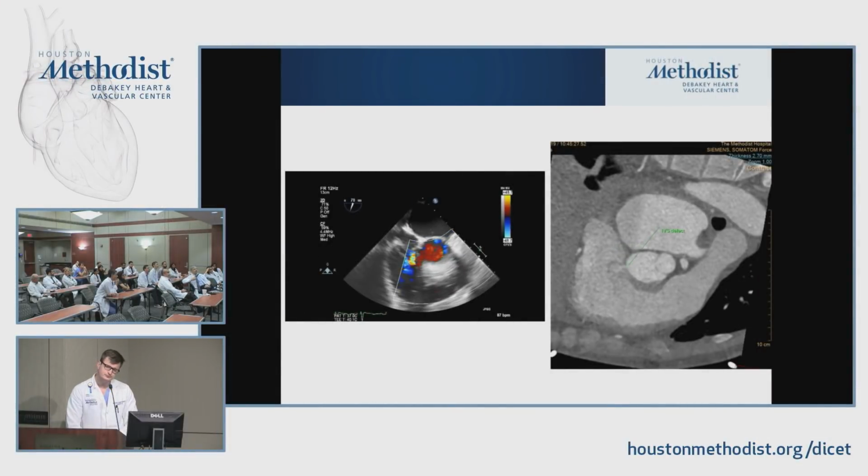What gets me concerned when you do CTA, right, is that it's hard to see flow because flow is everywhere. I mean, let's be critical here, right? It's hard to see flow because you're not looking at flow coming in, and you don't have any flow on the right side, and then left side contrast comes on board and I can see flow. Everything is white, right?